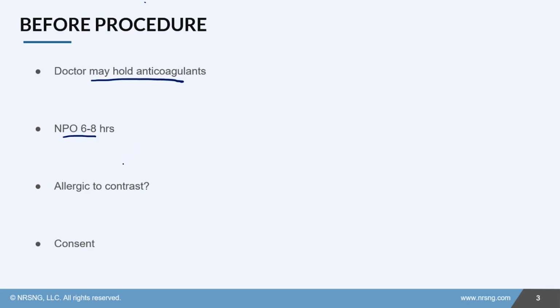Ask the patient if they have any allergies to any contrast dye and what type. Explain the procedure and have the patient sign the consent form. This consent can be done at the bedside before the procedure, that way the doctor can explain any risks to the patient.